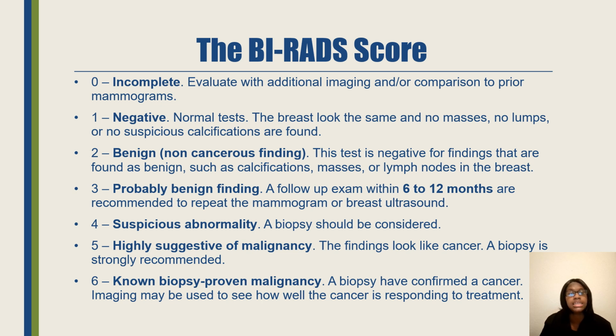If a patient gets a 0 score, that means incomplete. The patient needs to come back in for a follow-up mammogram, whether they're doing more mammogram pictures in a different way, or if they're doing breast ultrasound images to determine if something is a cyst versus a solid tumor. If it's number 1, that means it's negative, the test is normal. If it's a 2 score, then it's benign. And if it's 3, it's probably benign, so the patient will need to follow up within 6 to 12 months.